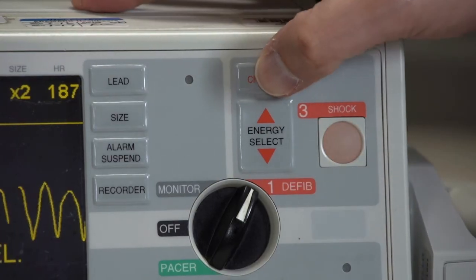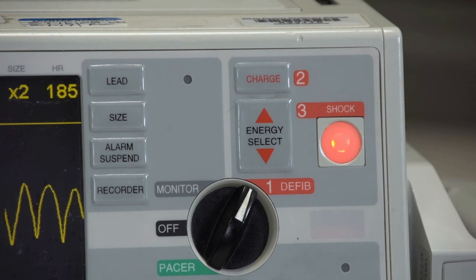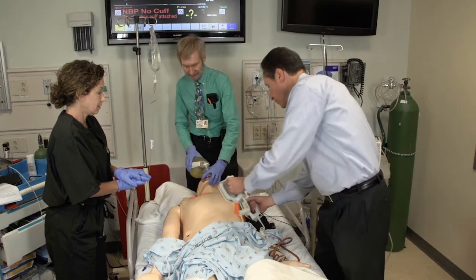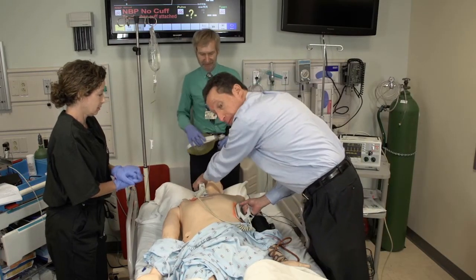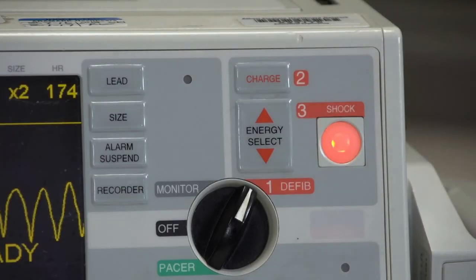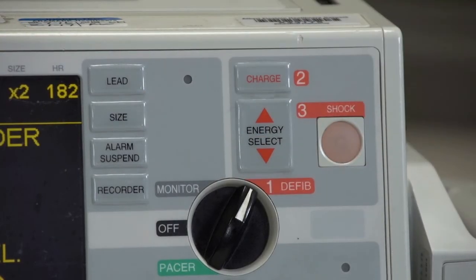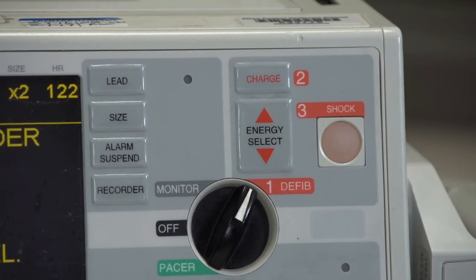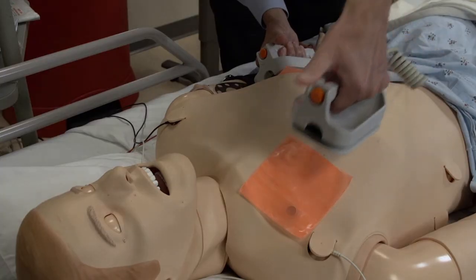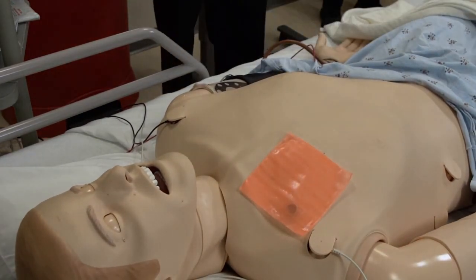Press the charge button. When the machine is charged, loudly state "all clear" and look to ensure that no personnel are touching the patient or the patient's bed. If using pads, deliver the shock by pressing the button on the machine. If using paddles, press down firmly on the chest wall and push buttons on both paddles at the same time.